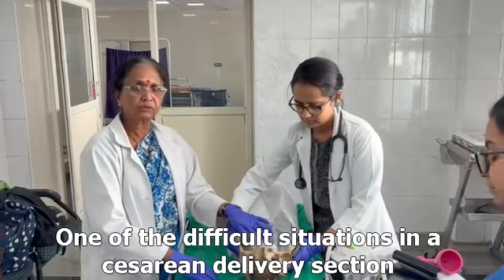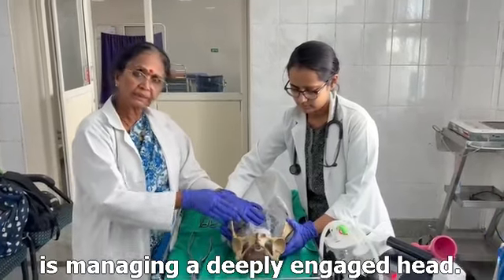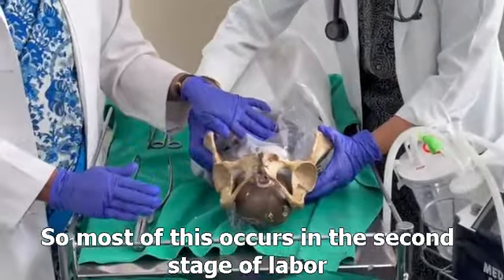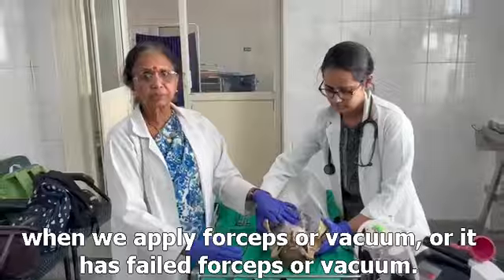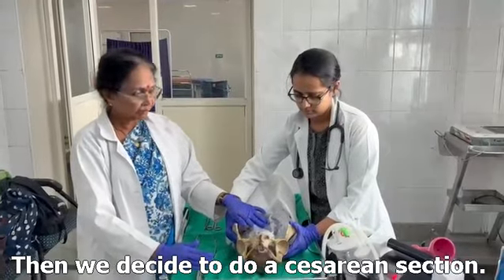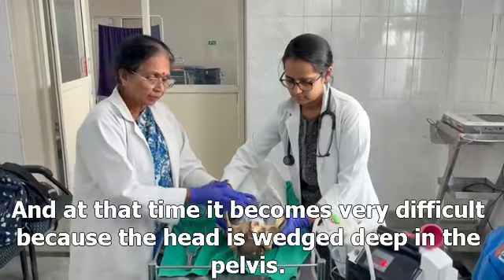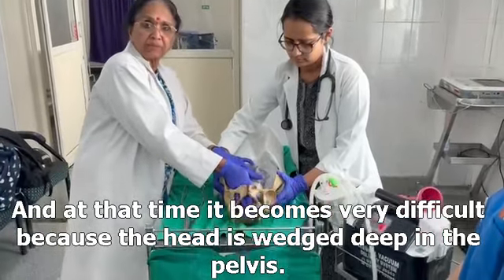A difficulty which we face during cesarean section is managing a deeply engaged head. Most of this occurs in the second stage of labor when we have applied forceps and it is a failed forceps. Then we decide to do cesarean section, and at that time it becomes very difficult because the head is wedged deep in the pelvis.